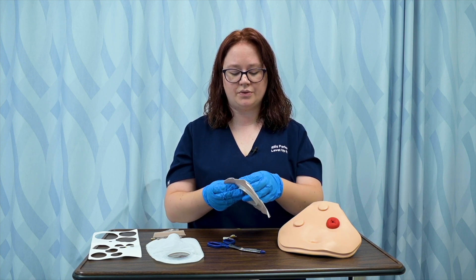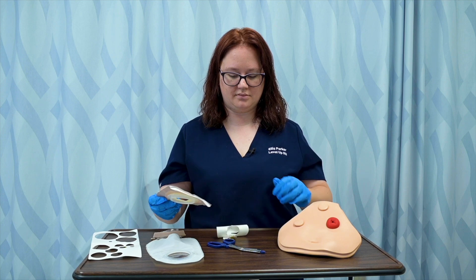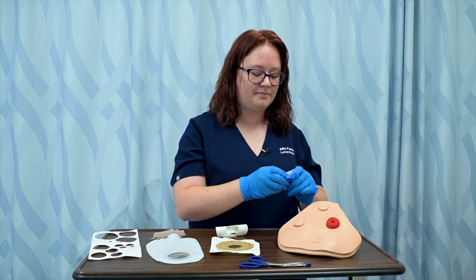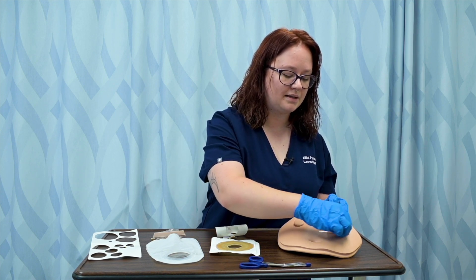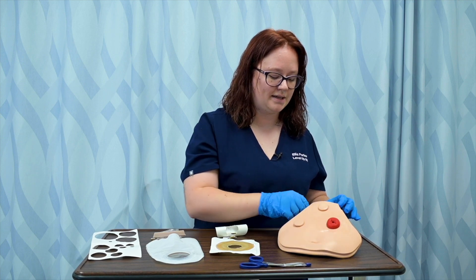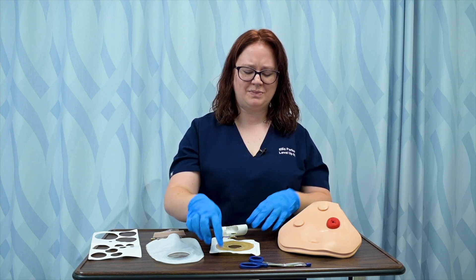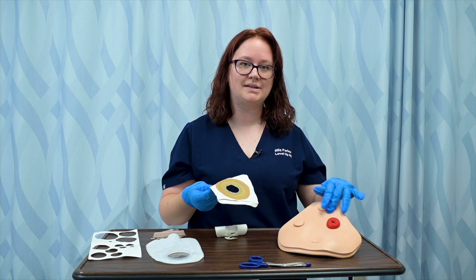I'm then going to remove the backing of it. I can get a pack of preparatory skin prep — something that prepares the skin for adhesive. It helps prevent breakdown and it helps when we're ready to remove the wafer, preventing any damage to the skin and skin breakdown.